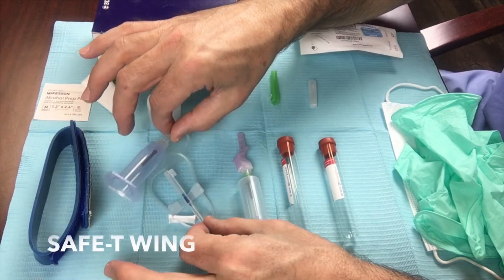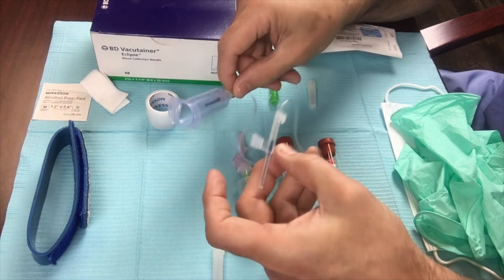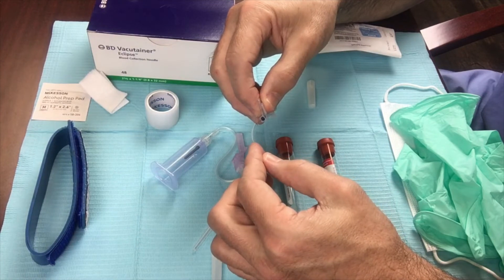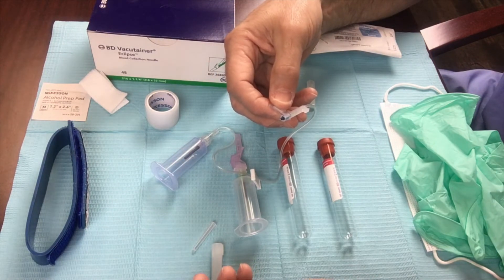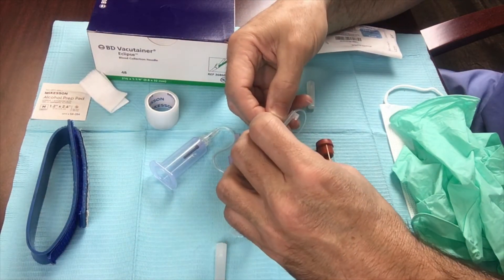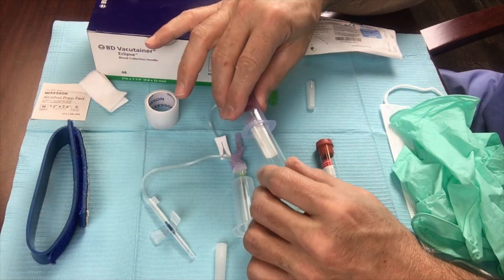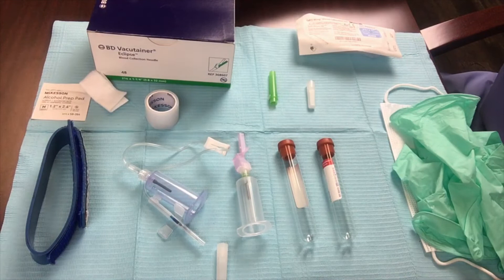A second system is what we call the safety wing blood collection set. It has a holder, a pigtail tubing, wings, and a beveled needle. Same thing — bevel up into the vein. You can also use this into an IV port just as I explained. You draw blood in the same fashion and secure your vacutainer red top blood collection tubes in the same fashion. They fill up and you can do two, four, six, eight — whatever you need. That is the second option for drawing blood.